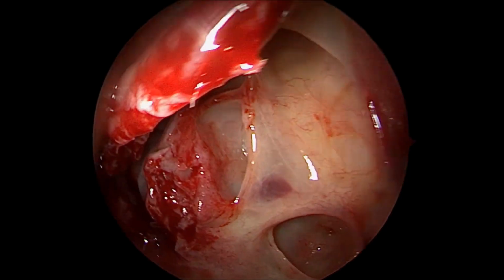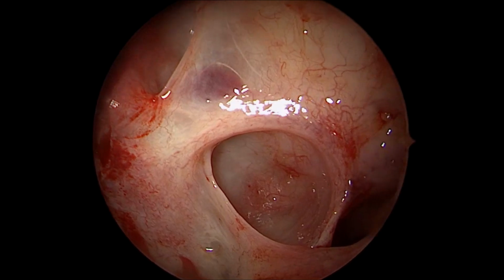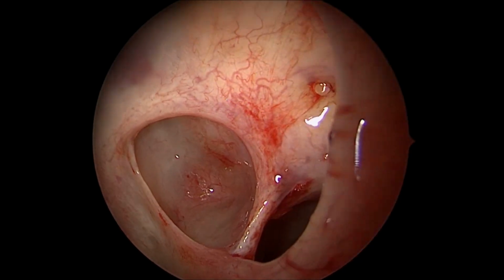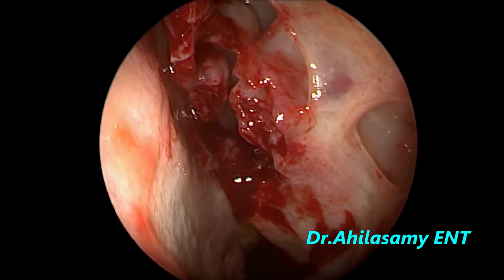It's a very wide natural ostia, and the accessory ostia you can see is quite wide enough, so I don't want to widen it since there is no pathology. With a 70-degree telescope, that's the view. Now I come to the 0-degree, hardly any bleeding.